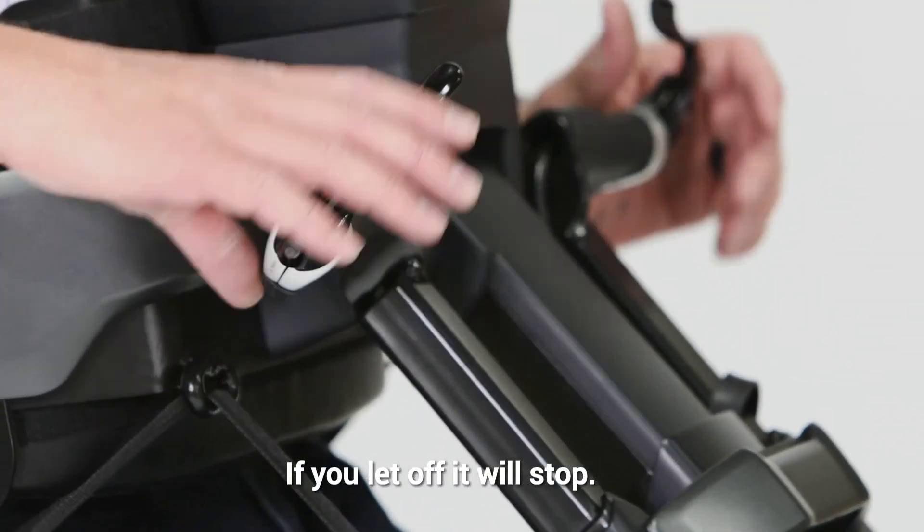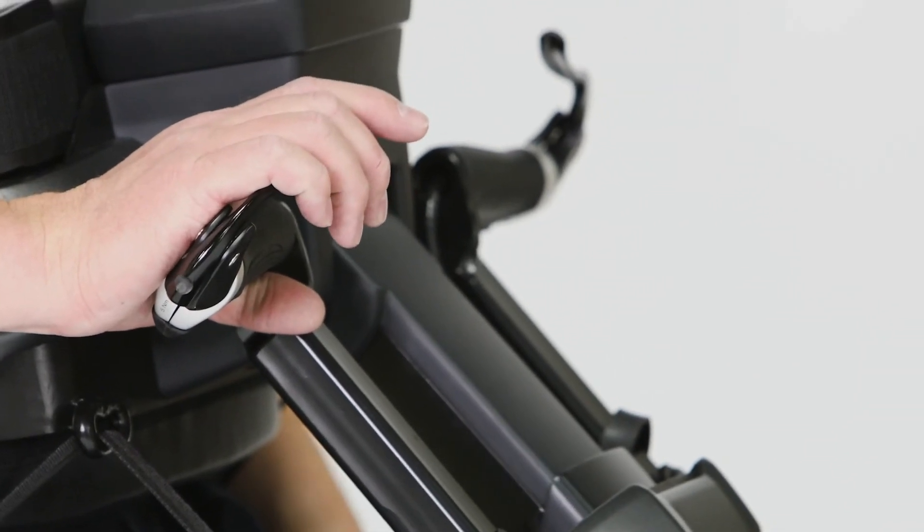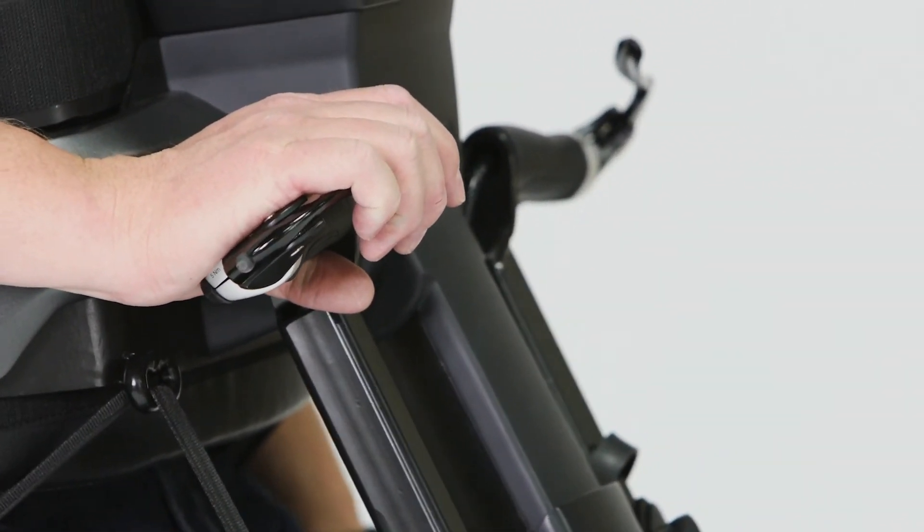At any point, if you let off the lever, it will stop. You can go back down or you can go back up.